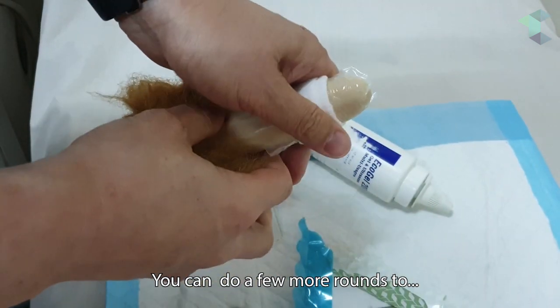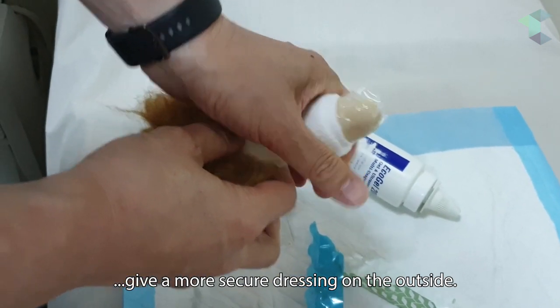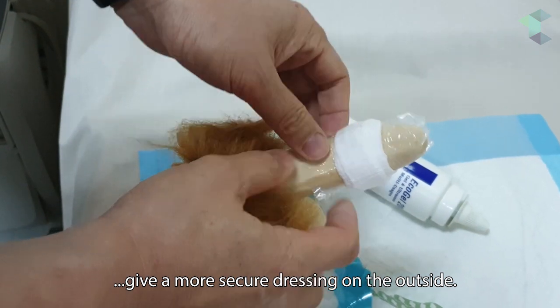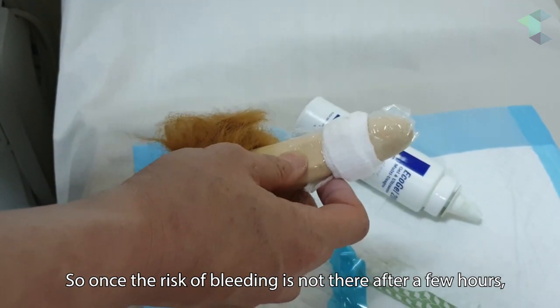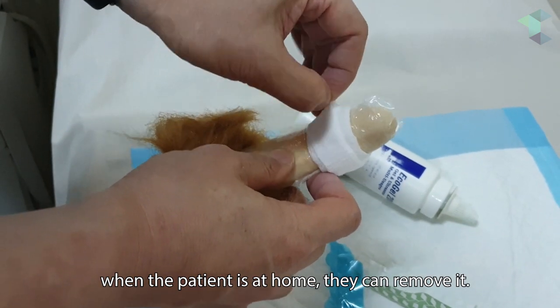You can do a few more rounds to give a more secure dressing on the outside. Once the risk of bleeding is no longer there after a few hours, when the patient is at home they can remove it.